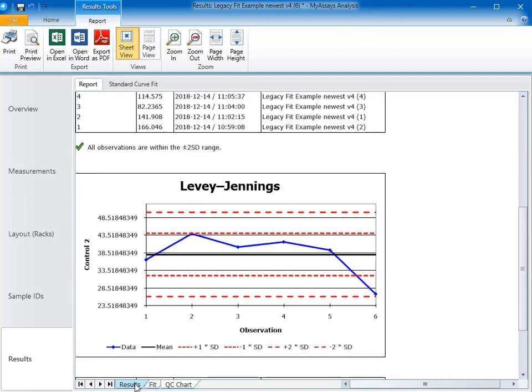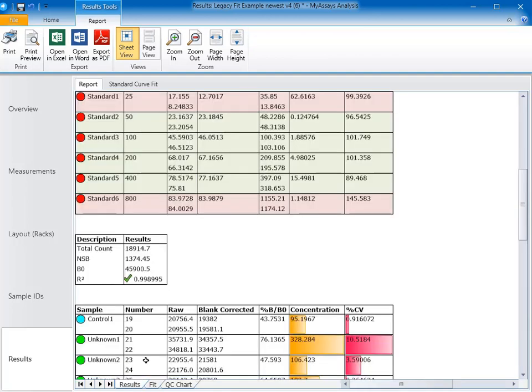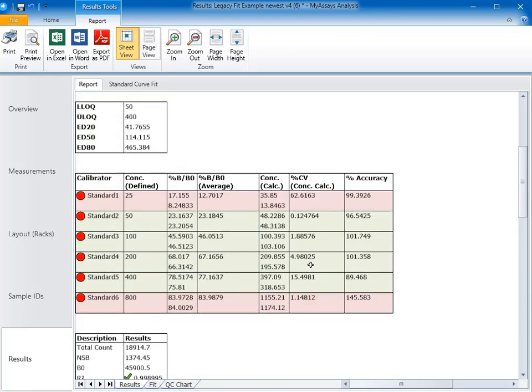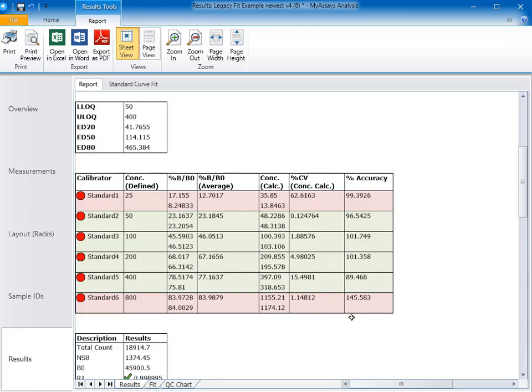However, when we view the curve data chart, we can see that both Standards 1 and Standards 6 fail our criteria. Standard 1 shows a low level of precision, as indicated by the high percent CV, which may point to an outlier. And Standard 6 has a concentration that differs too much from the defined concentration indicated by the percent accuracy.